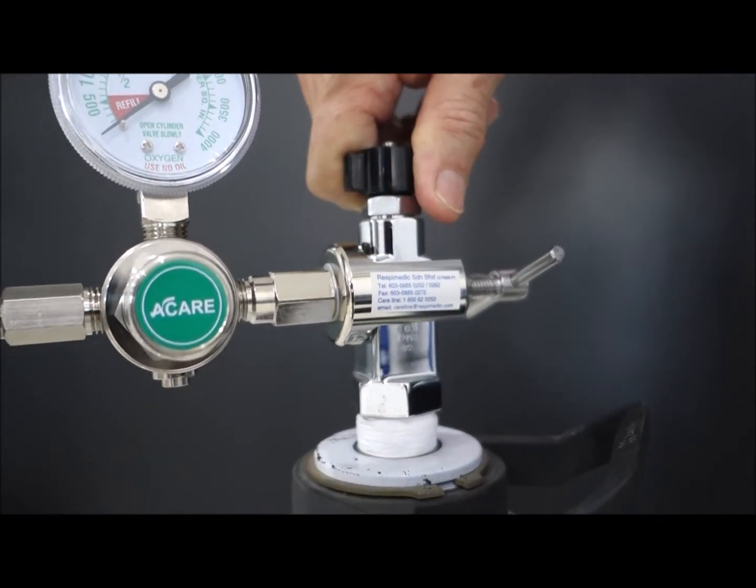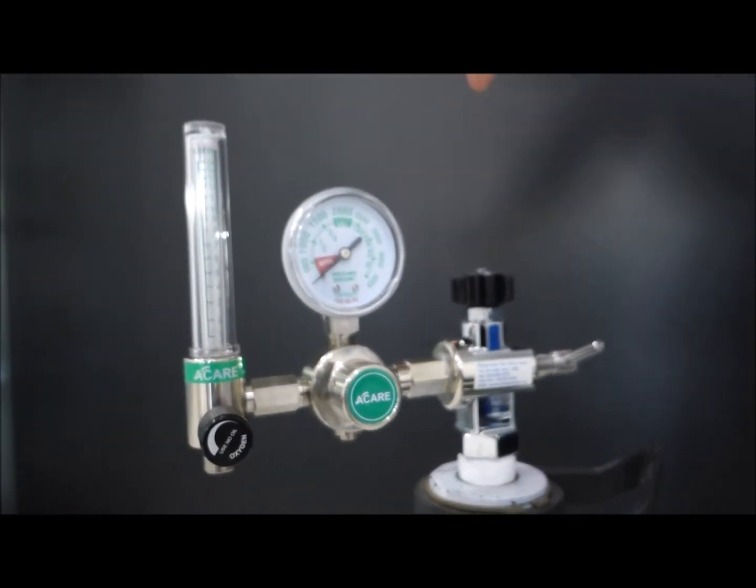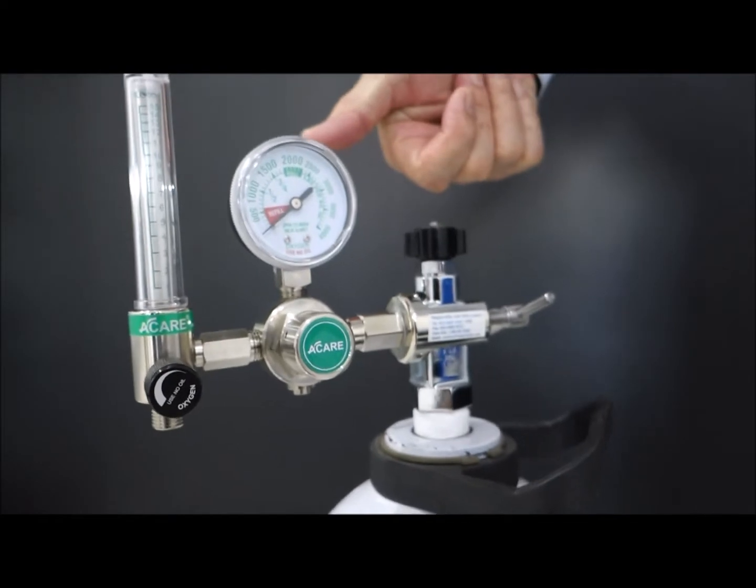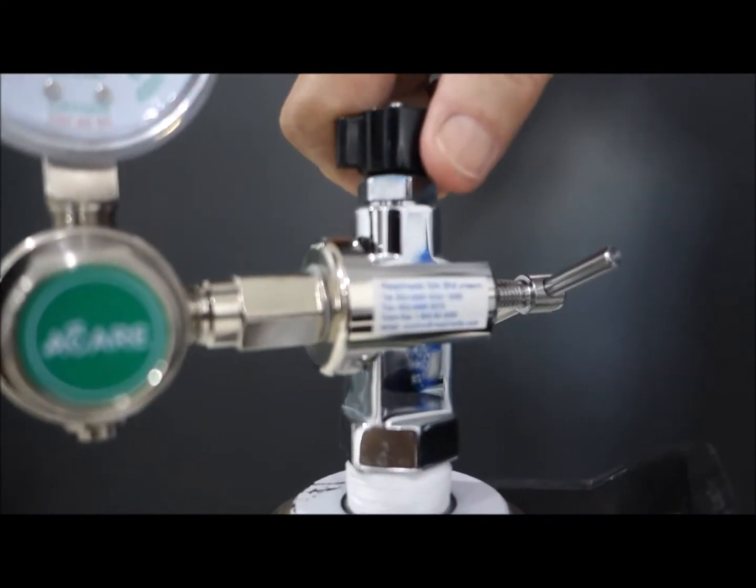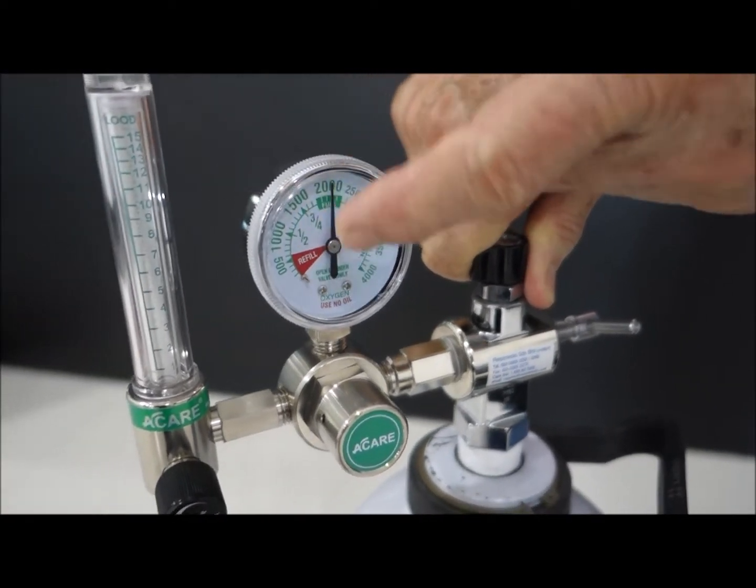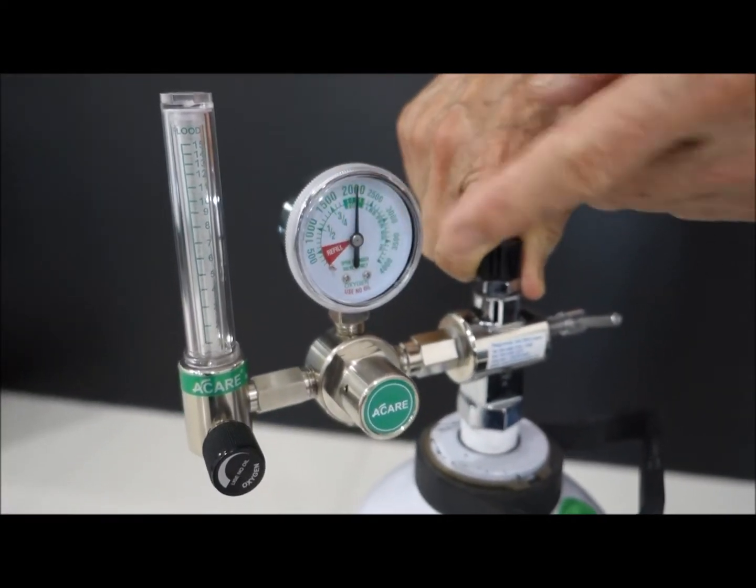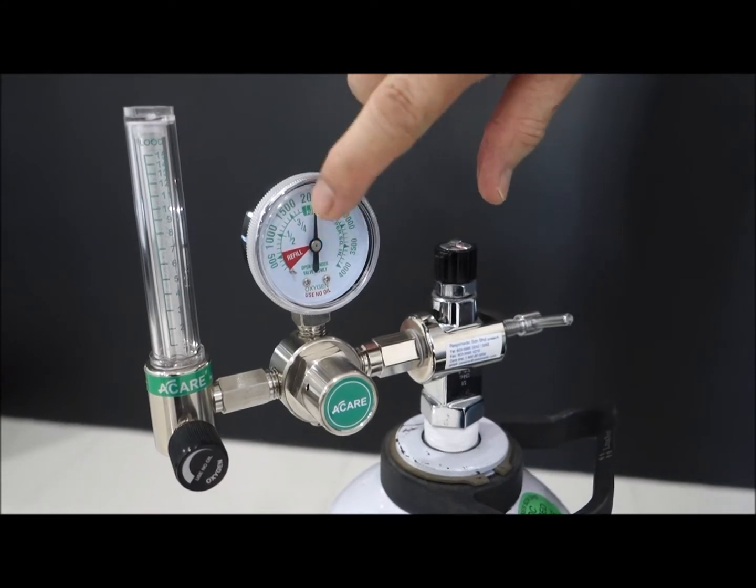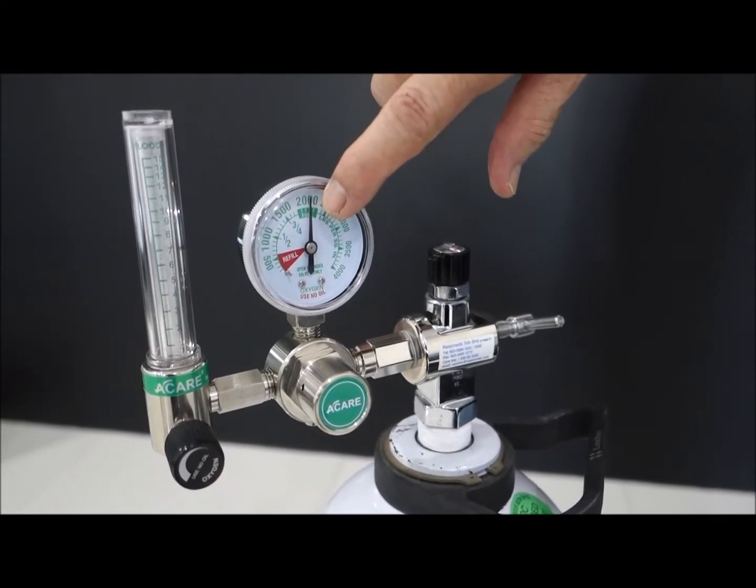The cylinder valve is turned on anti-clockwise to open the valve, and then clockwise to shut off the valve. So slowly turn anti-clockwise, and then you will see, as you turn, you will be able to see the cylinder content gauge will indicate some pressure.